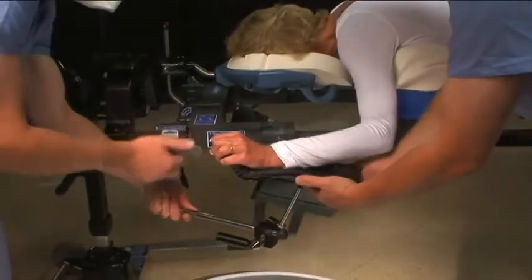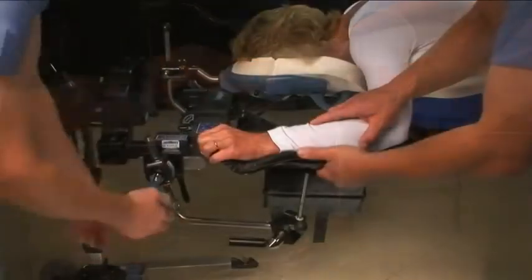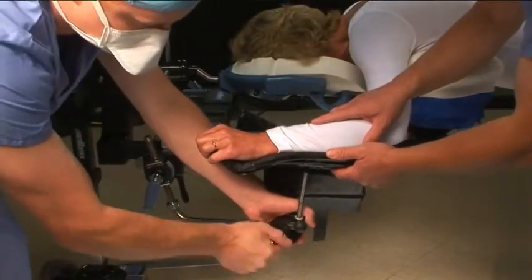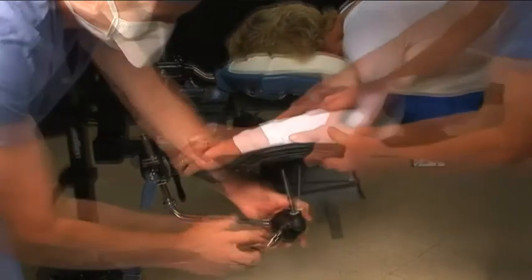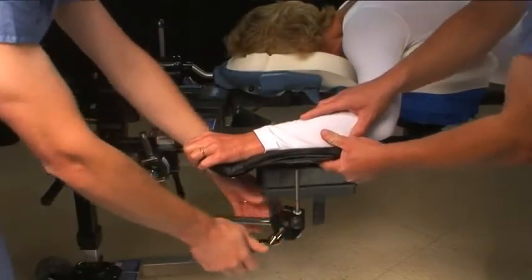Position the patient's arm at 90 degrees or less. Be careful not to stress the brachial plexus. One person should support the patient's forearm while the second loosens the knobs. Place the arm in the desired position and tighten all of the knobs.